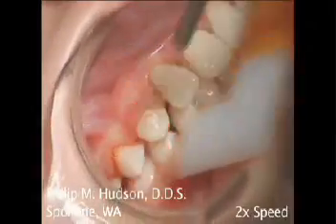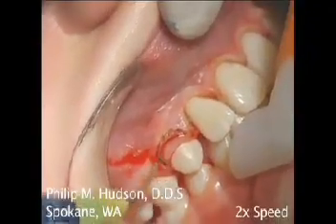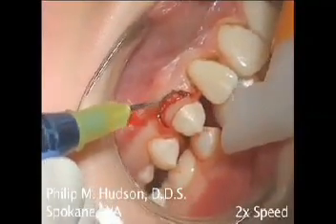But as Dr. Hudson demonstrates again with the laser, this procedure may be completed quickly, comfortably, with precision and efficiency, and with predictable results. Many patients in the typical practice could benefit from this type of laser dentistry in the aesthetic zone.